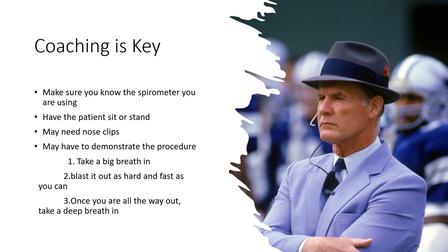That can be a little nerve-wracking sometimes, but you'll see the equipment nowadays is much more friendly than what it was in the past. Make sure you have the patient sit or stand. Sitting is the preferred method. However, they need to be sitting up straight. So posture or position is something that you should record on the report. Was the patient sitting? Was the patient standing? Did the patient have poor posture?